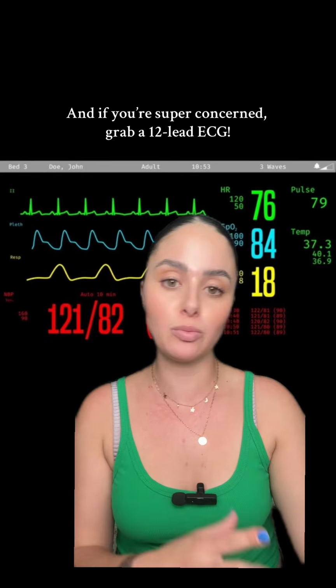When in doubt, change out all the little ECG stickers. You can also change out the cord, get a new monitor if possible, and just troubleshoot from there. Sometimes if you have machines close by or noise, that can also interfere with your ECG causing artifact.